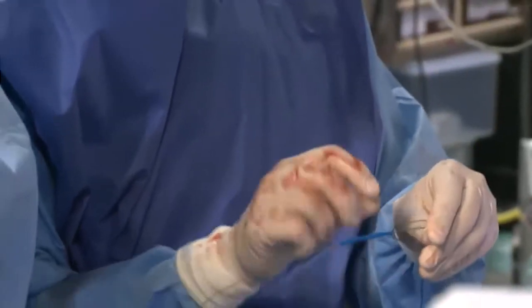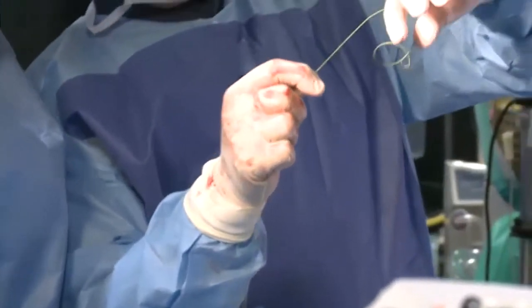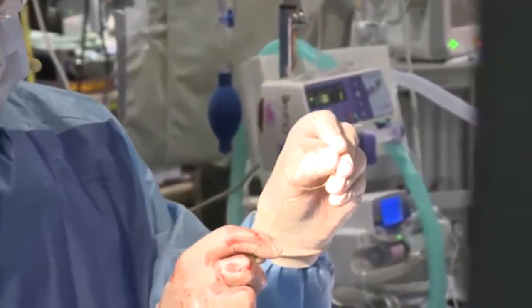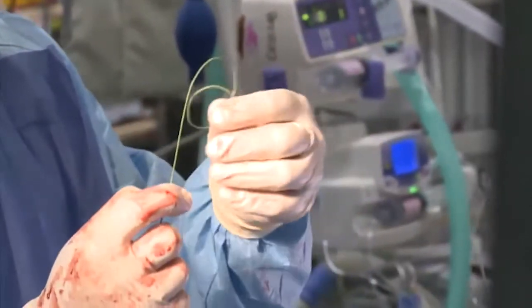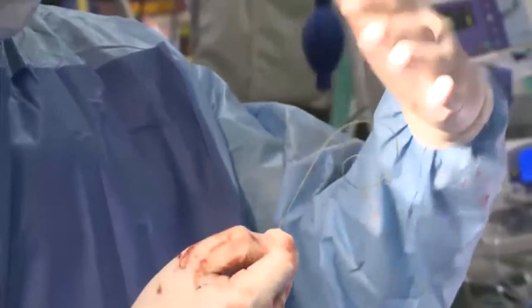An important question is, whenever a patient has a low gradient aortic stenosis. What do you think, Ravindra? Is this okay? This looks good. Are we okay to go in with this? Yeah. Let's go ahead and place this wire in the LV. The shape of the wire is important. That looks like it is not traumatic.